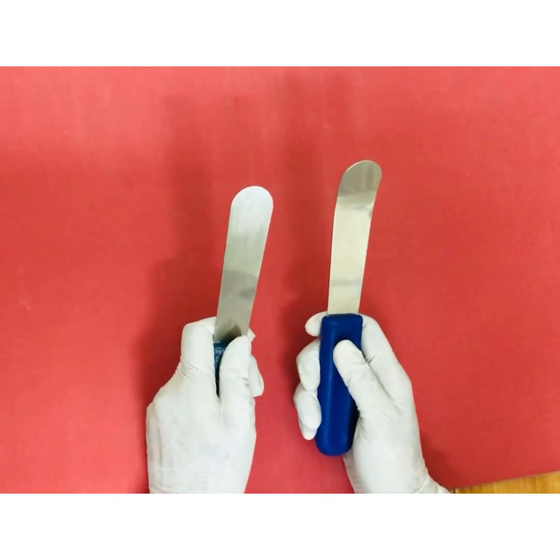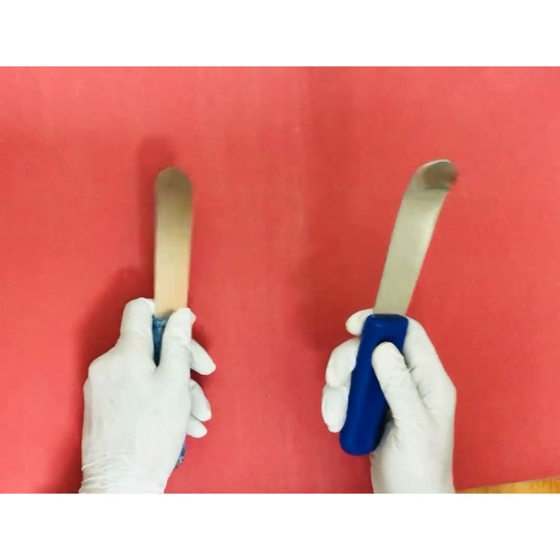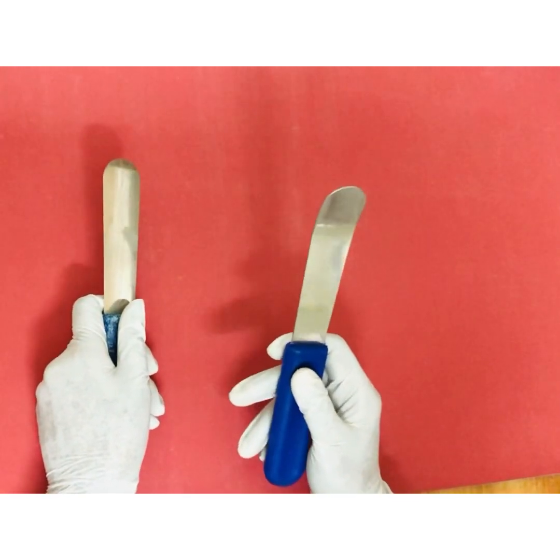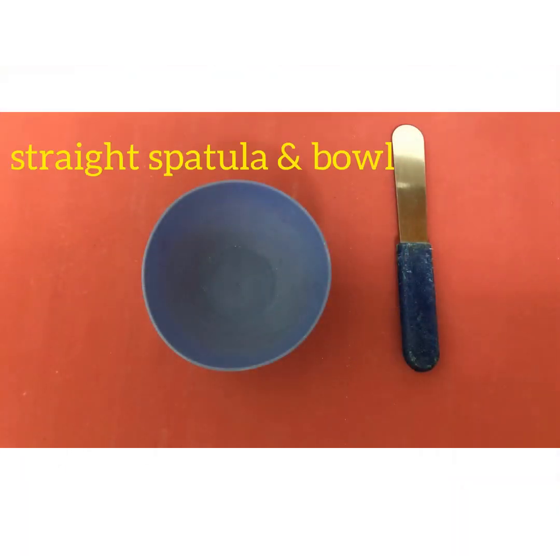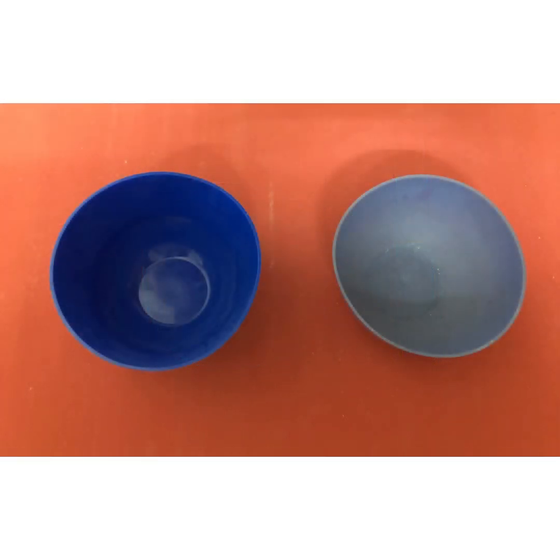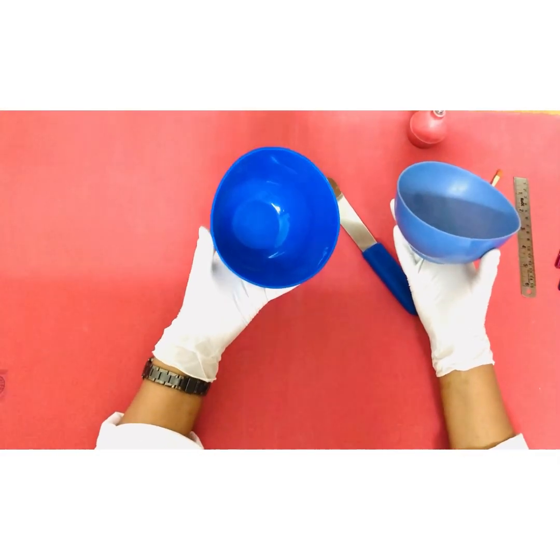In your instrument kit you will notice a curved tip spatula and a straight spatula. The straight one should be used for manipulating plaster of paris or dental stone. This is a straight spatula and a stiff bowl for mixing plaster of paris or dental stone. It's advisable to keep separate bowls for mixing alginate and gypsum products, because any remnant of plaster or even scratches left by manipulation or removal of dental stone can interfere with the properties.